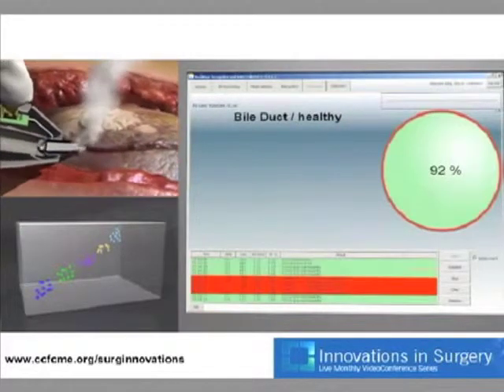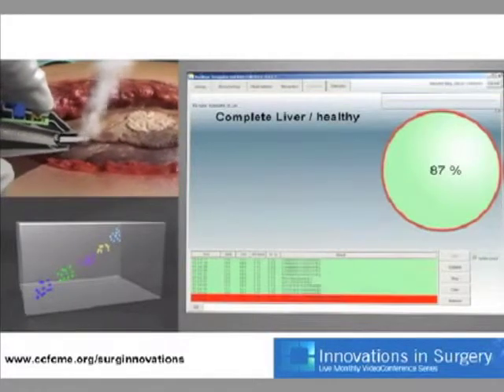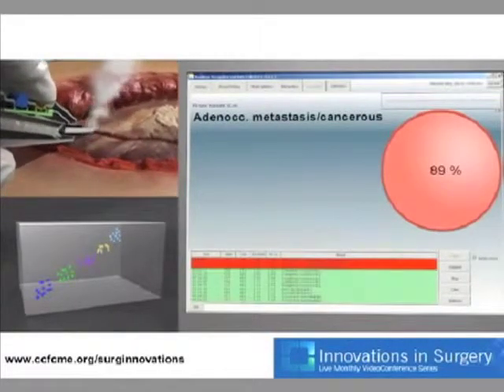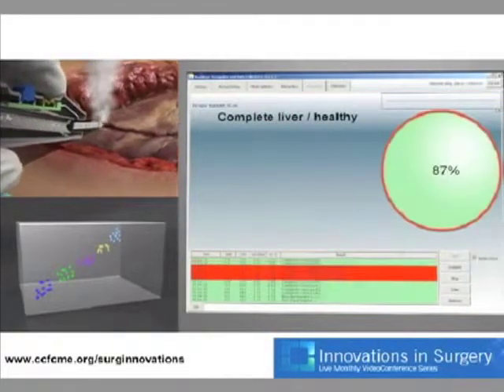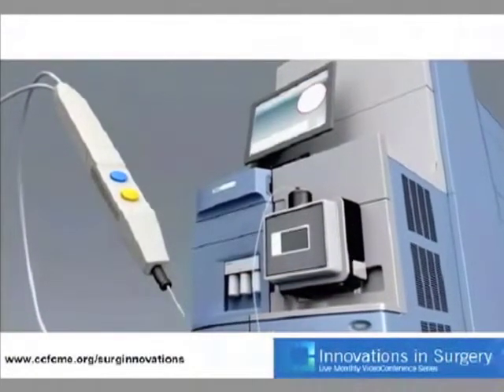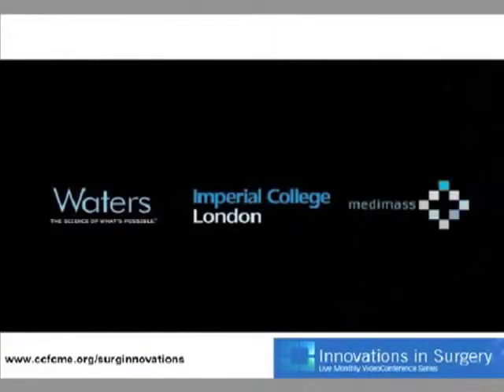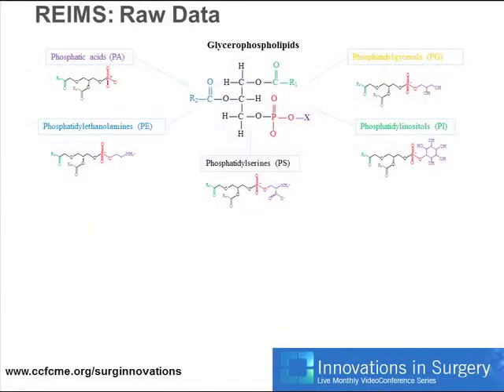So I mentioned to you before the basic methodology. We have a large validated histological database of numerous different cancer types, and we used predominantly linear discriminant analysis, which is a type of supervised multivariate analysis, to try and predict the origin of the spectra as they come out in real time. So next slide, please. That's basically what the device does.